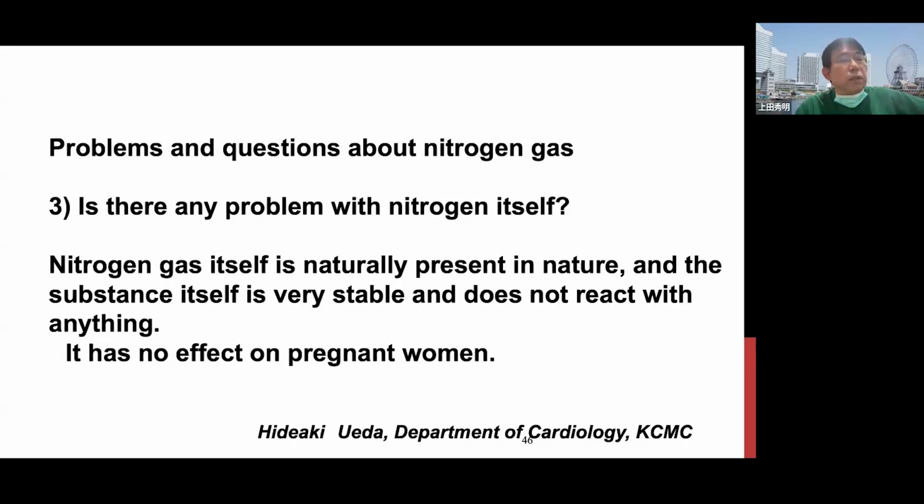So this is the end of my slide. I would like to mention the importance of diagnostic catheterization, and the QpQs to evaluate where the patient is and how the congestive heart failure is happening in that patient. Finally, if possible, I would like to recommend using nitrogen gas if the patient is suffering from high flow QpQs. It should reduce the pulmonary blood flow. Thank you for your attention.